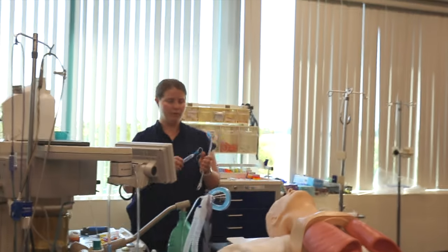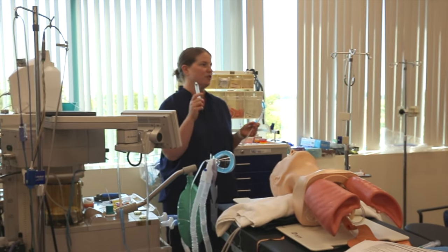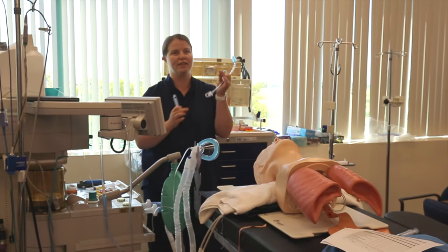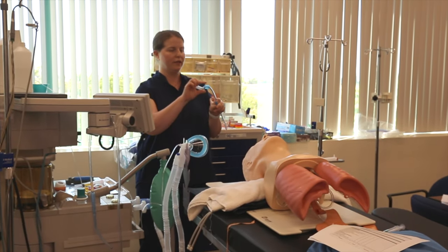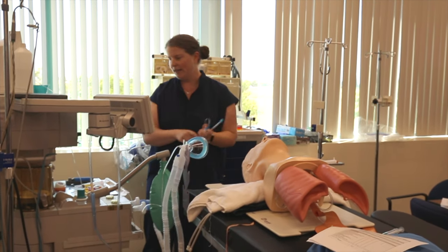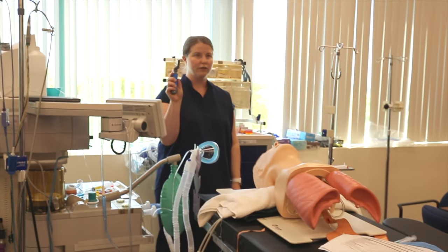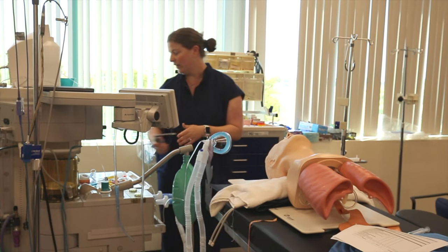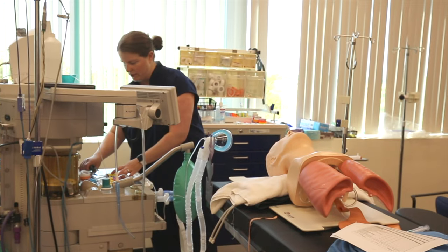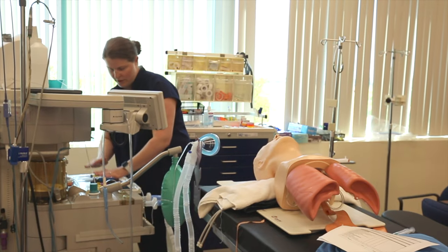So you're going to make sure your balloon works. You have to disconnect the syringe to make sure that the balloon works. If you keep the syringe connected, you're not actually testing the valve on the pilot balloon. So you're going to inflate the balloon, make sure it holds pressure, and then deflate it, and you're going to keep your syringe attached to your ET tube. Your laryngoscope, check it, make sure the light works. Just blinded myself. If the light does not work, get a new handle or replace the battery. I like to keep this kind of tidy. So that was my airway.